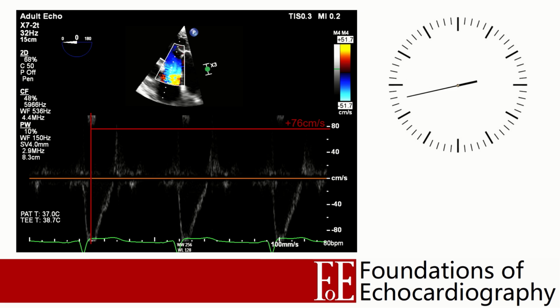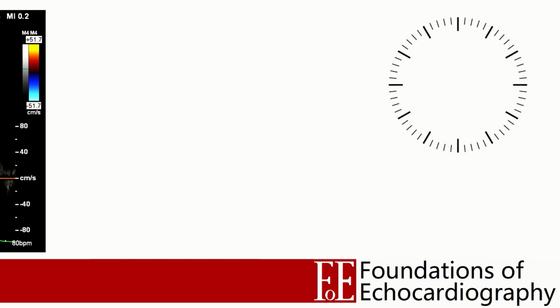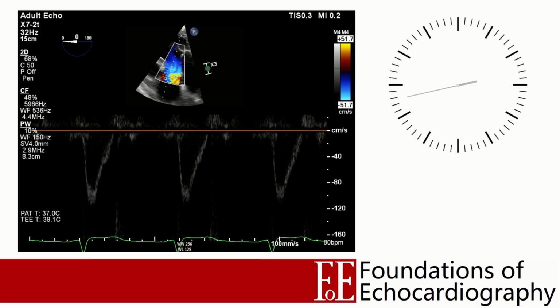When we're in this situation, when the velocity exceeds what we can measure, but by less than double, we can get around this by telling the ultrasound software which direction the blood is moving in. We do this by adjusting our baseline, so this graph is identical to the previous graph, but the baseline has been shifted towards the top. We are telling the ultrasound software that we know the blood is moving away from us.